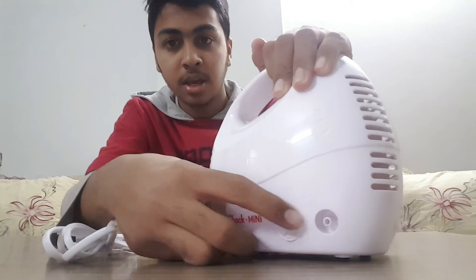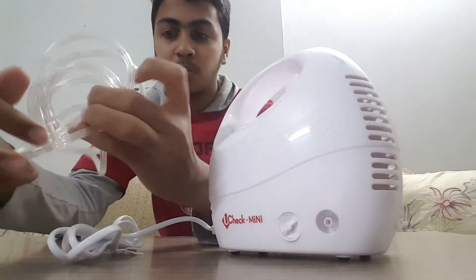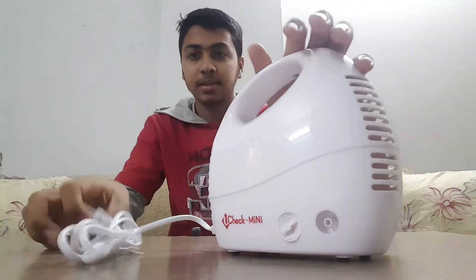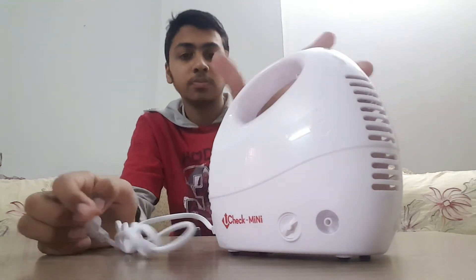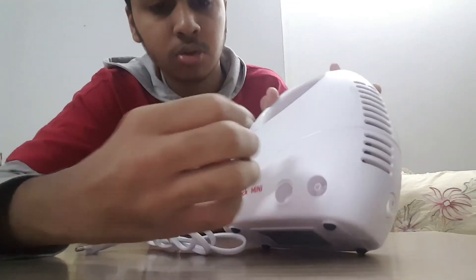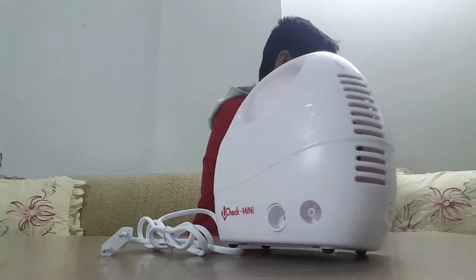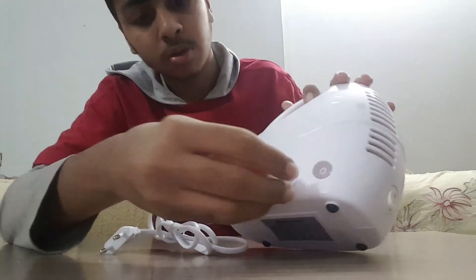As you can see on the mini nebulizer, this is where you insert the pipe — one side goes into the machine and the other into the mouthpiece. This is electric-powered. You can also change the filter to clean it. If you open it, you can see there is a foam filter inside. You can exchange this if it gets brown.